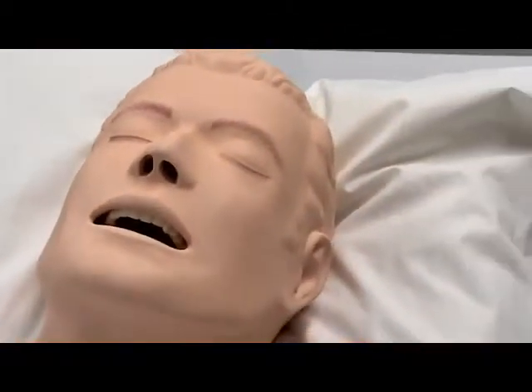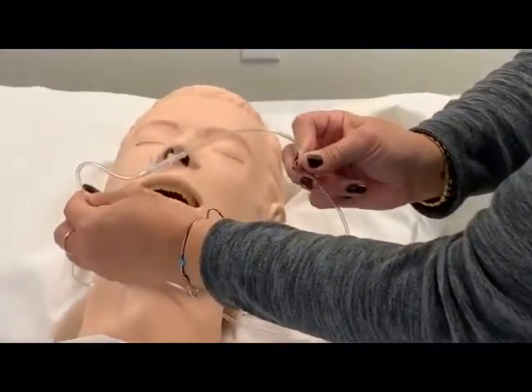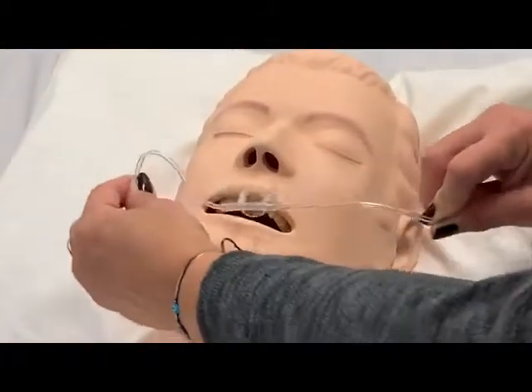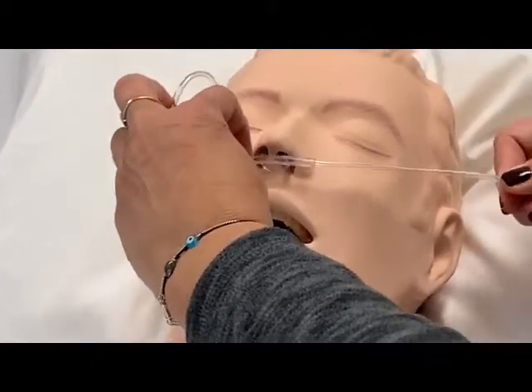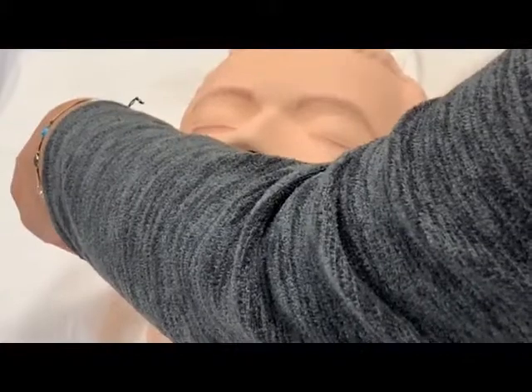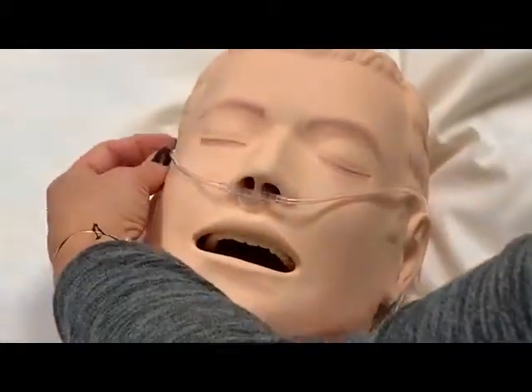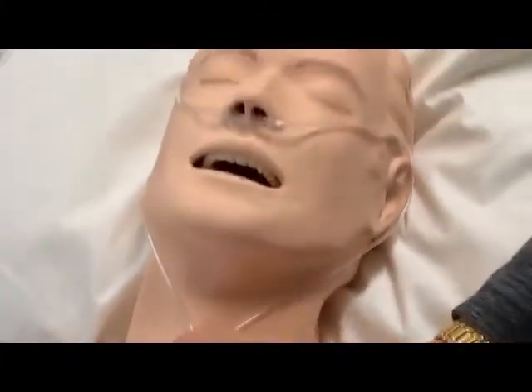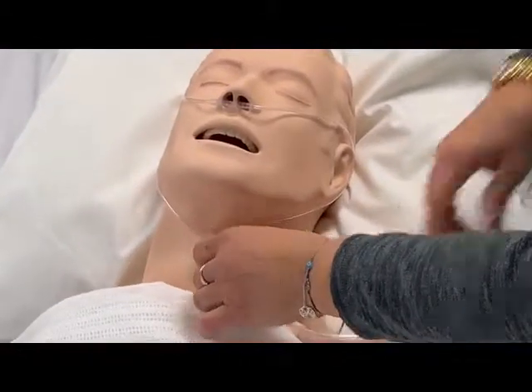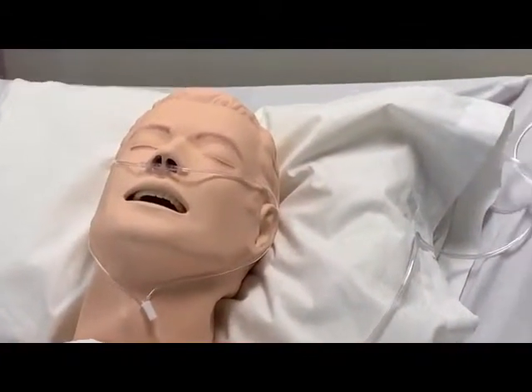When I do go to place it on my patient, I'm of course going to explain to my patient that I'll be placing some oxygen on them. I'm going to hold the nasal cannula like so, again so that it's following the natural path of the nose. I'm going to insert it here. And then the easiest way is to hook it around their ears so that they're not lying on that tubing, because we don't want to cause a pressure sore on our patient. You can just move the lariat a little bit up to make it a little bit snugger, but not too tight on the patient. And that's exactly how a nasal cannula will go on a patient.